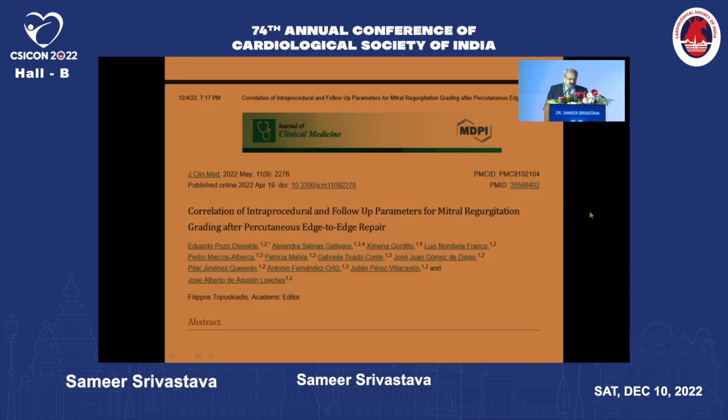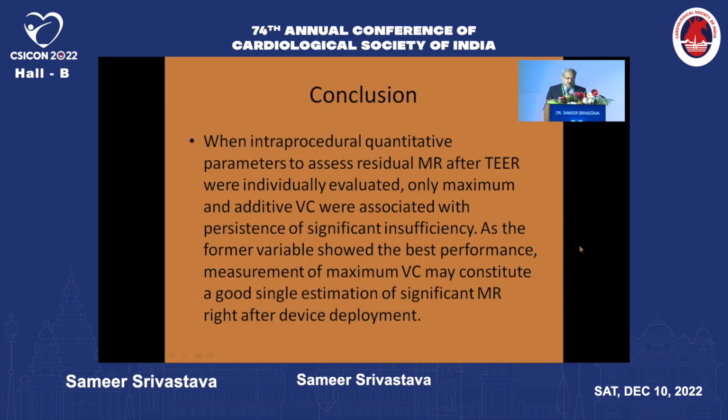This is a paper published in May 2022, correlation of intra-procedural and follow-up parameters of mitral regurgitation grading after percutaneous edge-to-edge repair. And this is what they concluded.